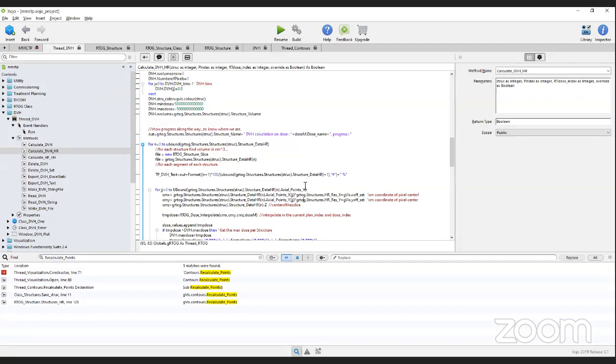So it really depends on the application, because we can't get micro slices using our CT scanner in the clinic. But the DVH at the end is also controlled by the structure. We can always with Monte Carlo make the dose resolution as small as possible because we control these voxels. Yes. Not a problem. But the problem is the image. The CT image comes at a given resolution.